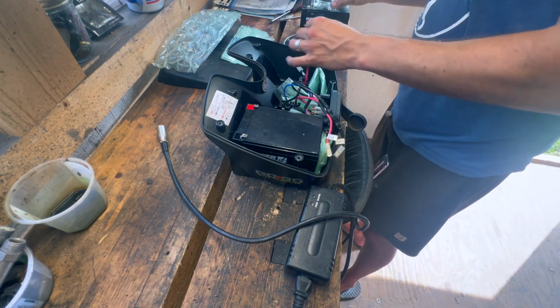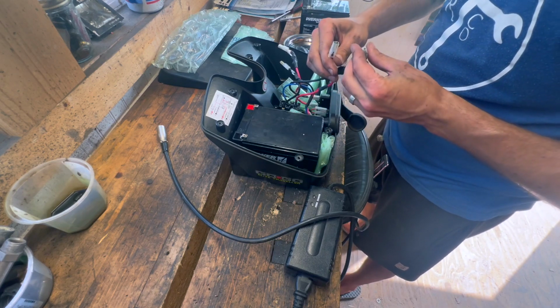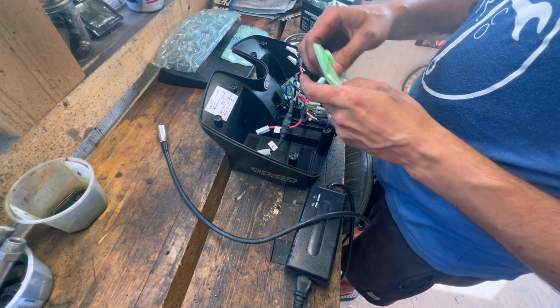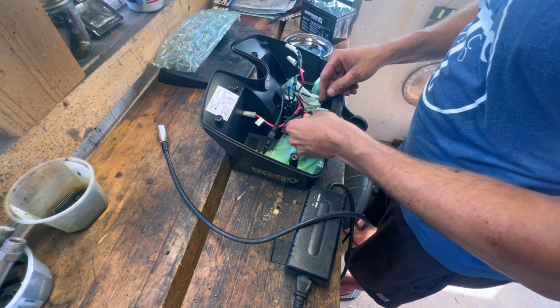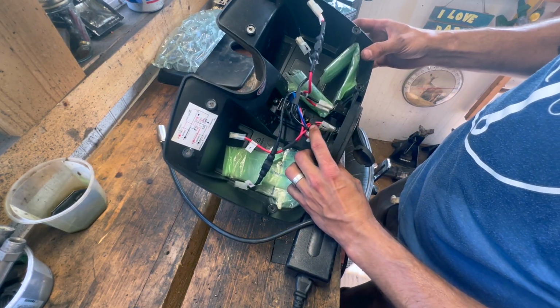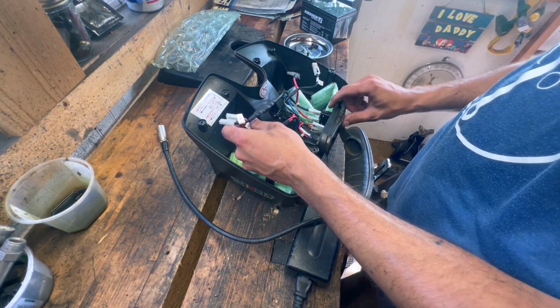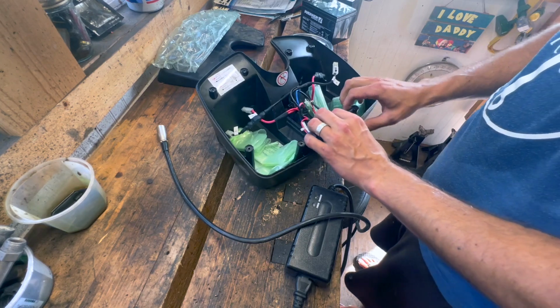I don't know if that little bit of corrosion would prevent it from charging. We've got obviously the 2 batteries. And there's just a bunch of baggies in here for battery padding. So I don't see anything obvious. There goes from the battery to the fuse here. And then where's this one run from? There's a little switch here. I'm not sure what that does.